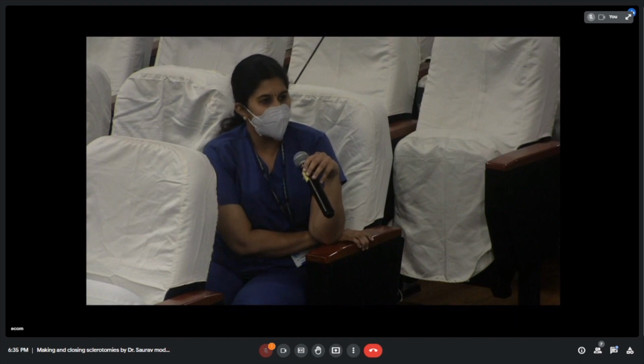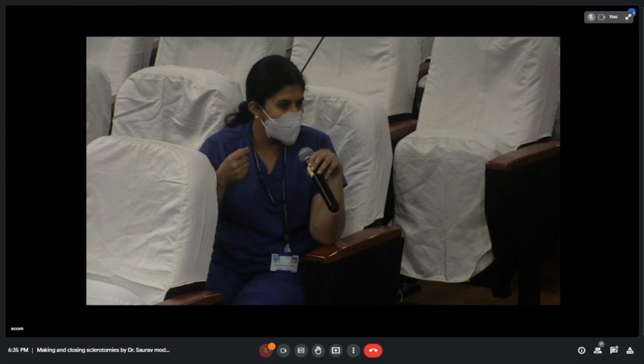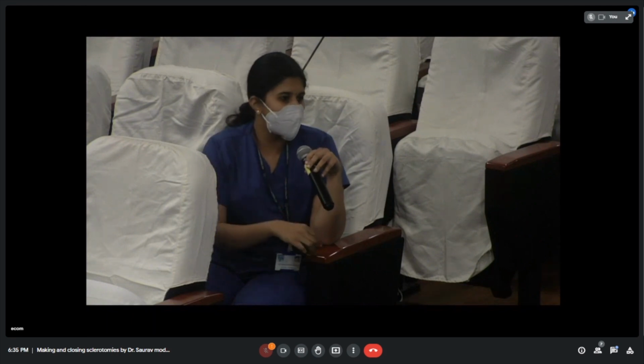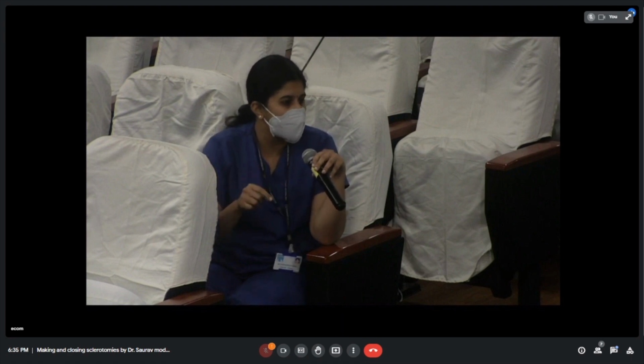When we are not happy with the sclerotomy, the entire surgery can be painful. More commonly, when you withdraw the instrument, the cannula can come along with it, and that is a very common thing we see. Please do change the cannula. And when we reinsert, instead of going in with the instrument, it is better to go in with the trocar, put the cannula in again, and then go in with the instrument. Every time you go inside and come out, you are meddling with the vitreous around the sclerotomy site.